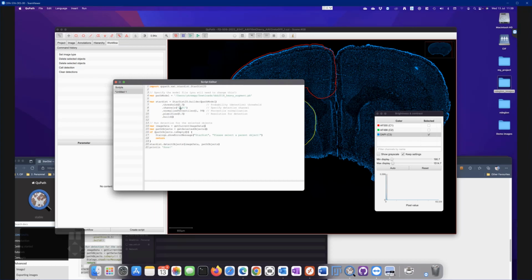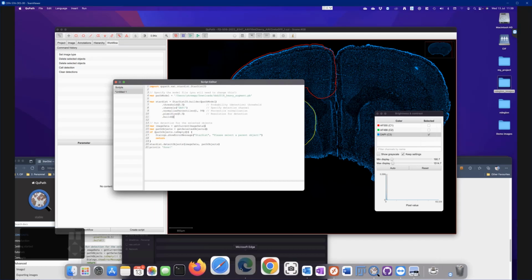You have to make sure that the right channel is used, so here it's obviously DAPI that is used, so this is fine.